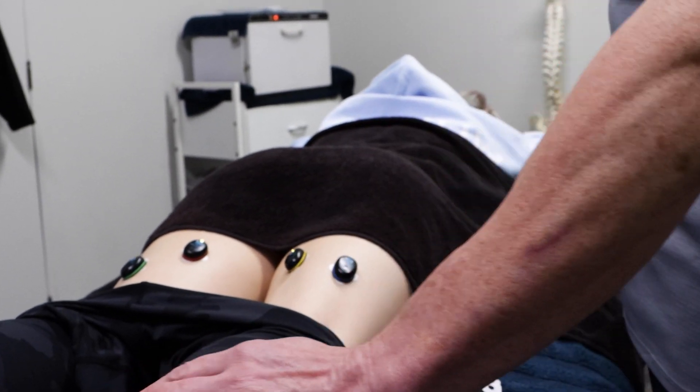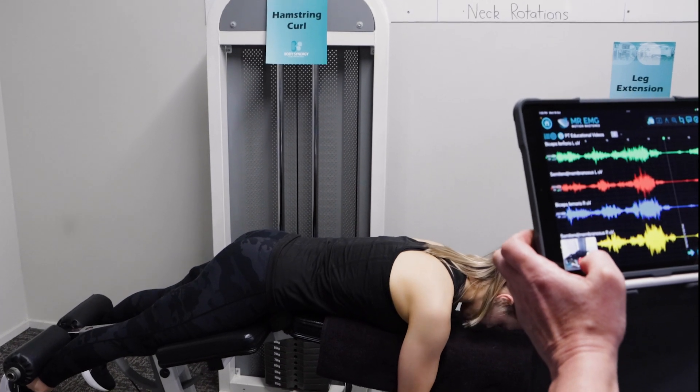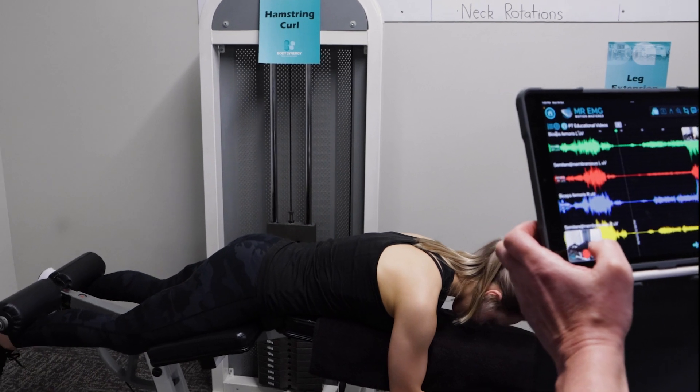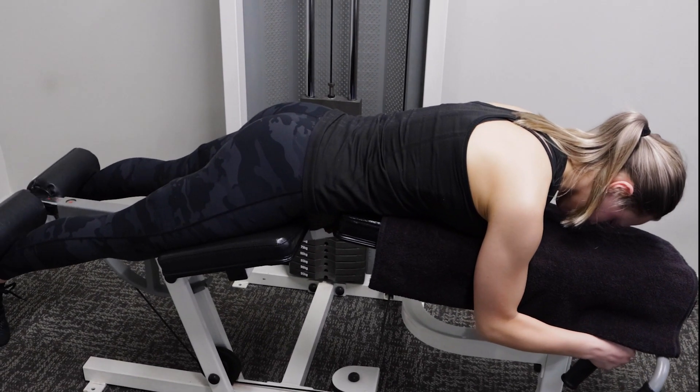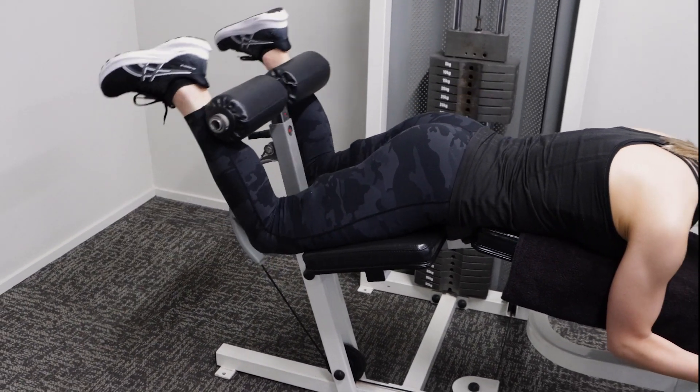In this video we will test five exercises in total. Let's begin with 35 kilo lying leg curls. Ensure you test the same number of repetitions for each exercise and use loads that create an equal challenge for your client across all exercises.